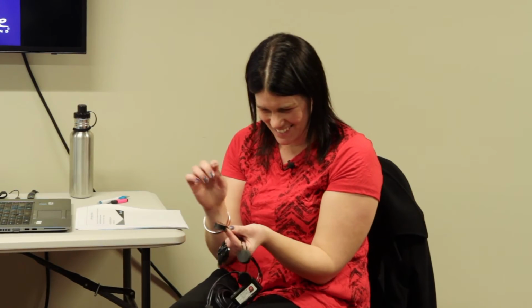Space. I can see Steve's raising her hand. And basically as you get up to it, it's picked up that your hand's near it, and it picks up the capacitive forces of your skin and activates it. When you activate these switches you can't hear it, so you only know that you've activated it because the chair's going to do something, or you might hear the motors click. You can set up a proportional type control with it, and the closer you get to it, obviously the more signal it's picking up, and it can make the chair go faster. It's not a function I've used, but it's something that might be worth knowing about.